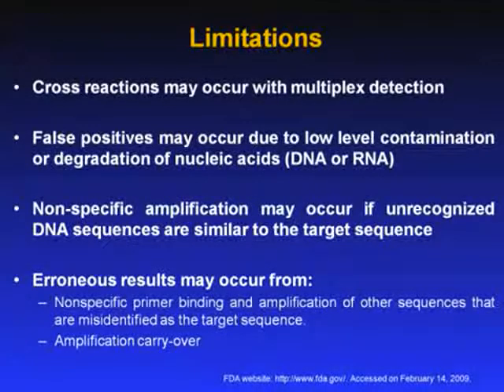Many of these issues can be overcome with proper primer design and decreasing the complexity of the nucleic acid recognition instrument. For example, a less complex point-of-care nucleic acid recognition system with limited operator handling will likely have less contamination issues than a complex laboratory-based nucleic acid recognition system requiring extensive operator handling and processing steps.